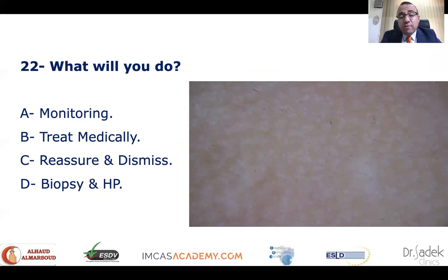Can we go for medical treatment, or do we just dismiss because we don't think he will respond? Well, based on the dermoscopic images that I see, there are still hair follicles that are viable. There are black dots, there are erupting very short hairs, but yes, he might benefit from more medical treatment. And I only give up when it's totally fibrosed.